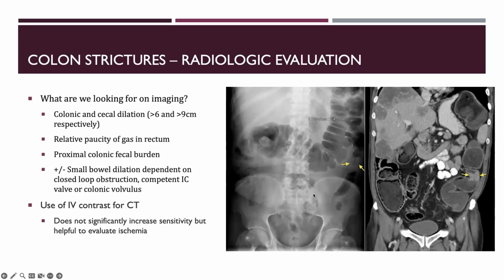An x-ray is a great place to start that says yes or no, let me be suspicious for some sort of obstruction, but innately we all like to go in with more information. And so a CT scan is really quite helpful for this.